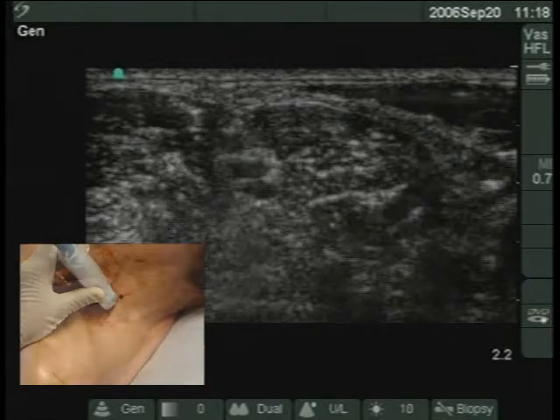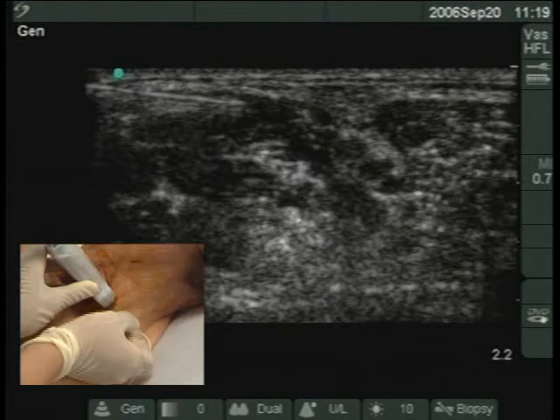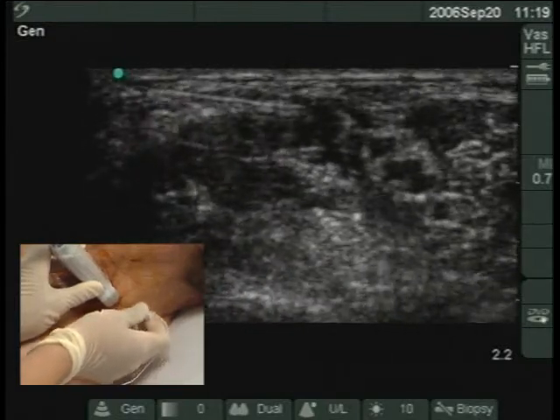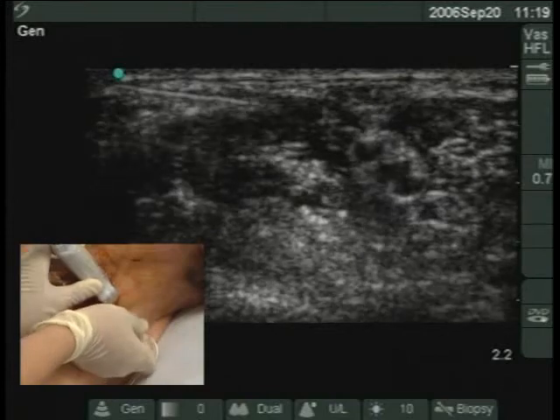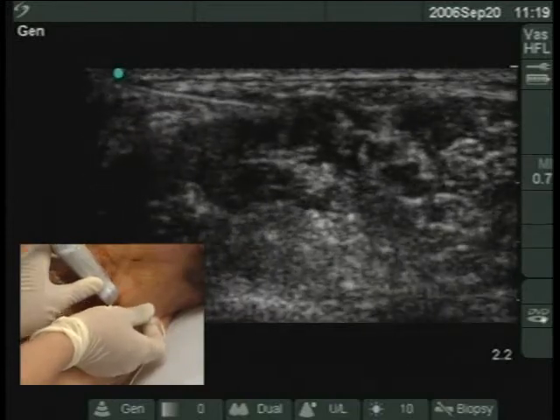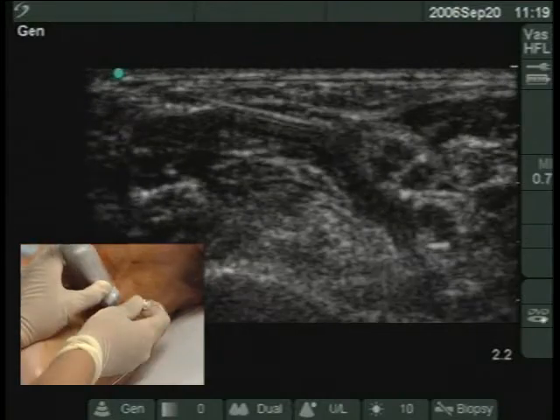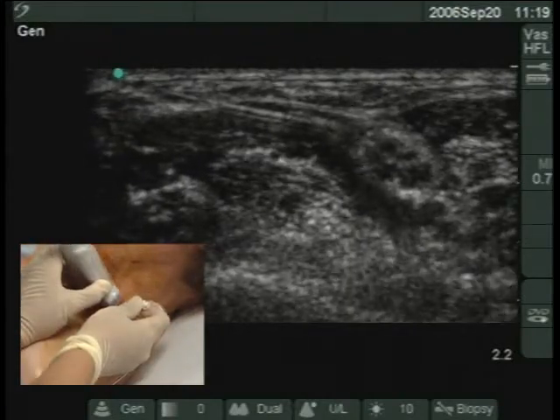A 22-gauge, 50-millimeter short-bevel needle is inserted in-plane from the lateral side of the transducer. Ensure that the needle tip is visualized at all times. If the needle tip goes out of plane, adjust the transducer with vertical, rotational, or lateral movement. The needle should be visualized as it traverses the scalenus medius to enter the interscalene groove.